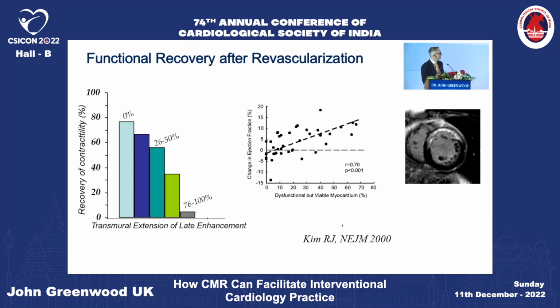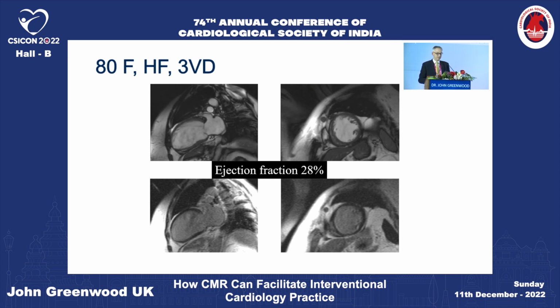Why is scar important? Well, we know that the more scar there is, the less likely the myocardium is to recover after revascularization. So assessing the transmurality of the scar has been shown in multiple observational studies to identify those patients who are going to get functional improvement with revascularization. And here's just a case example.